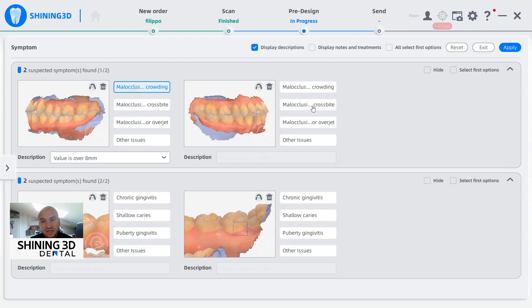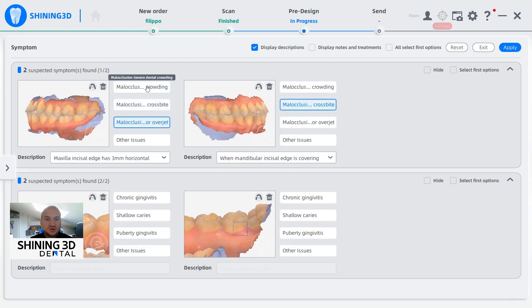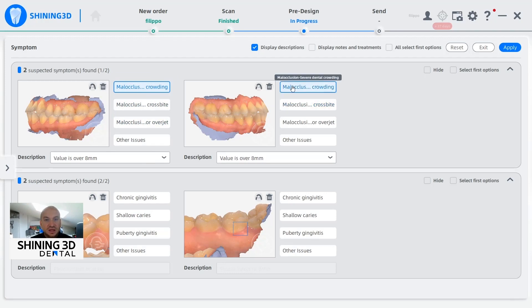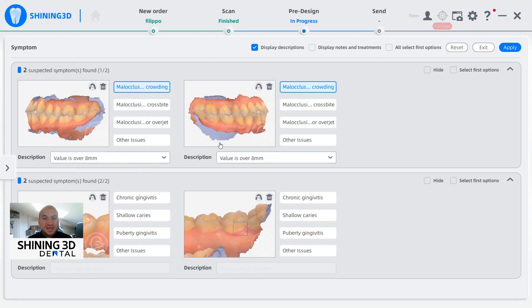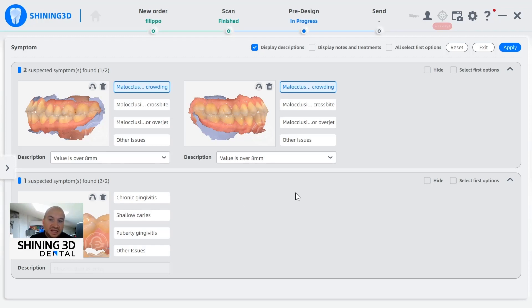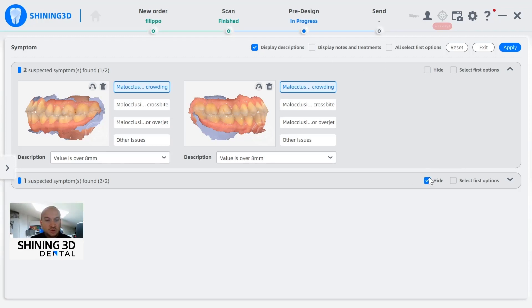Malocclusion crowding, malocclusion crossbite — the doctor simply needs to select what the artificial intelligence automatically detects. In case the artificial intelligence made a mistake, we can simply delete it, or we can also completely close the second part, because basically the artificial intelligence is able to divide the issues into different groups.